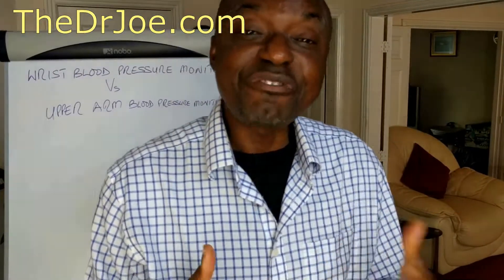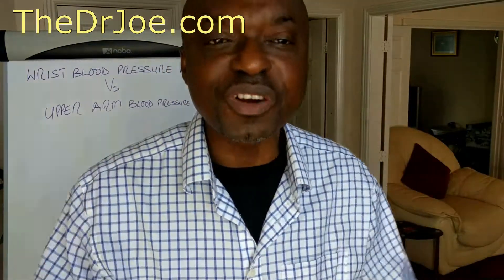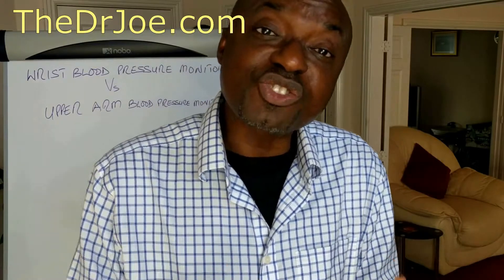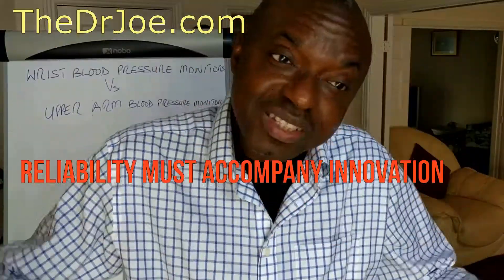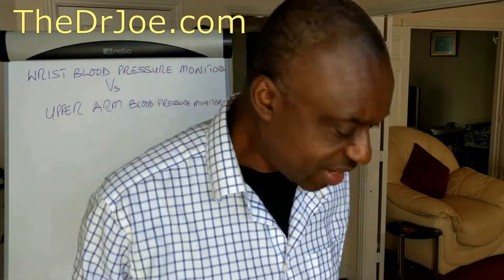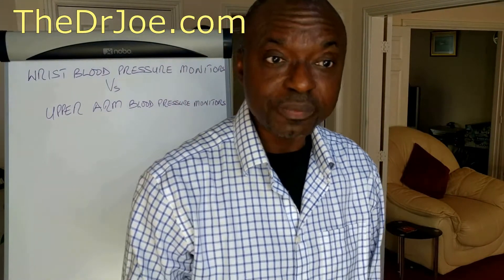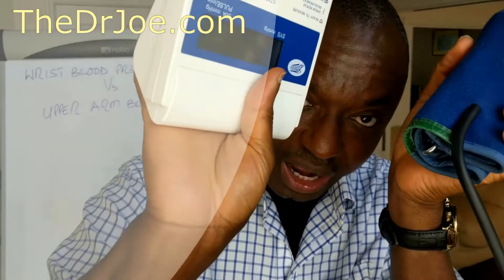You might think, by virtue of this video presentation, that I am anti-innovation. Well, I'm not — nothing could be further from the truth. I'm all for innovation, but if innovation does not come with reliability, I'll be asking myself: what is the point? I've tested a lot of these wrist blood pressure monitors and in my opinion they failed the reliability test. It's for that reason I will not recommend the wrist blood pressure monitors. If you're watching this video, stick with the upper arm monitors.